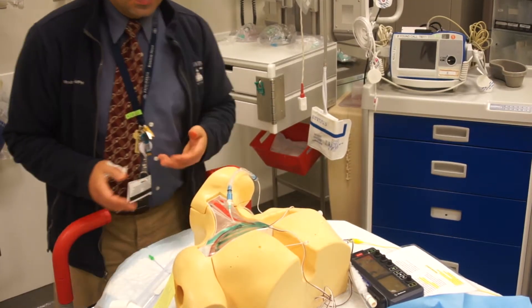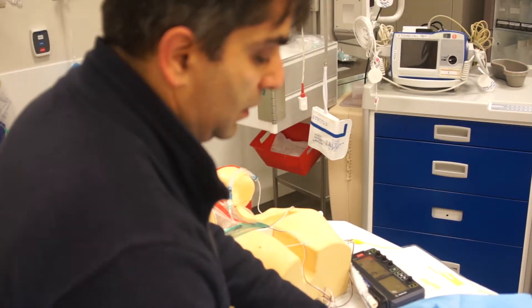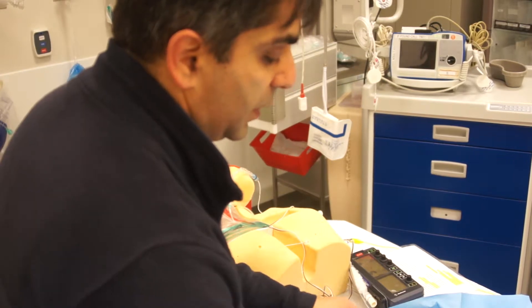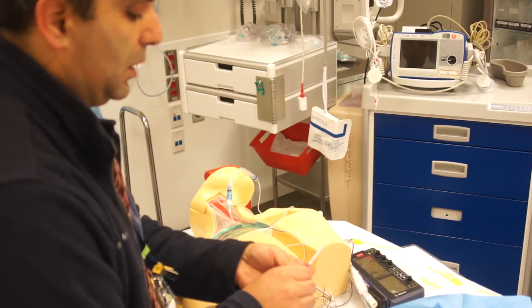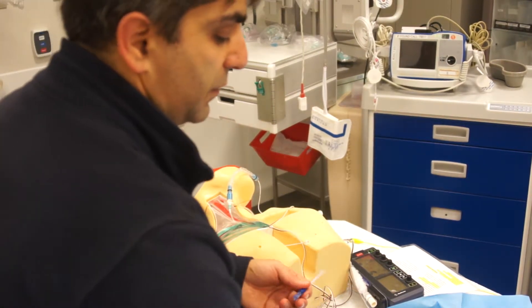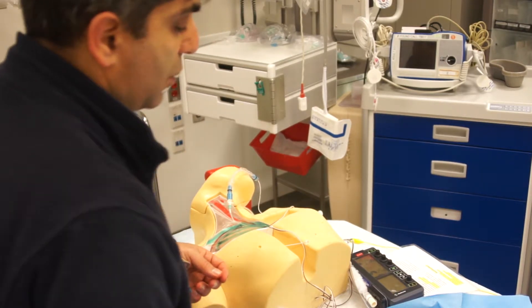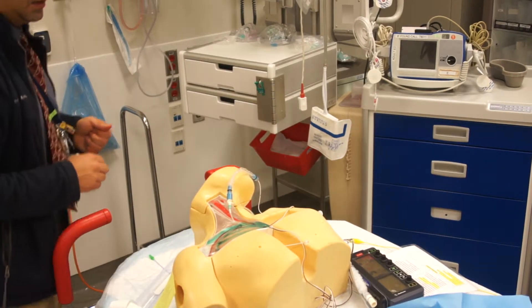If that occurs, I recommend getting a very long needle and doing a pericardiocentesis, which is beyond the scope of this. But if you're in a pinch, you can always use the 18-gauge needle that comes in the catheter — thread it in there and suck off as much blood as you need. If that happens, the first call you should make is to your CT surgeon because they will need to come down and help you out.